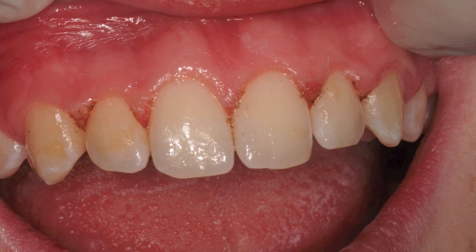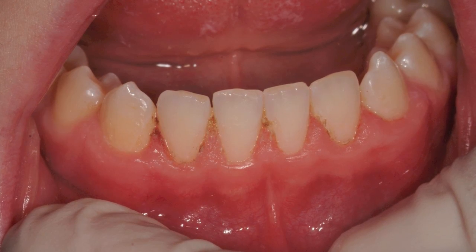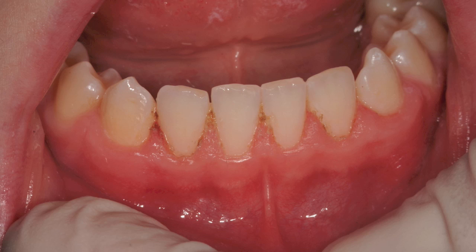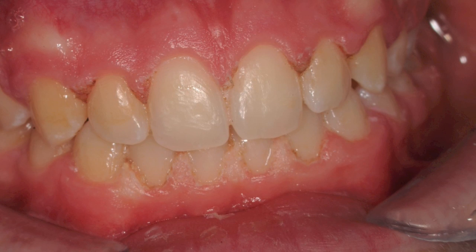Now we turn our attention to the lower anterior teeth, where we're able again to remove gross amounts of tissue that were creating the bulkiness and large papilla. We're also able to use some hydrogen peroxide to get an immediate effect on the tissue itself.